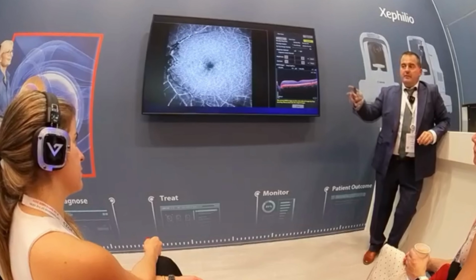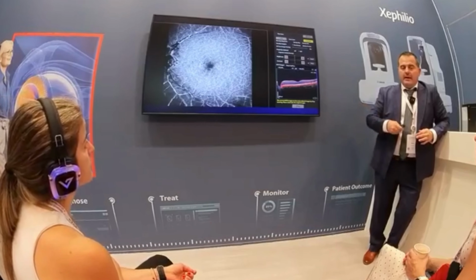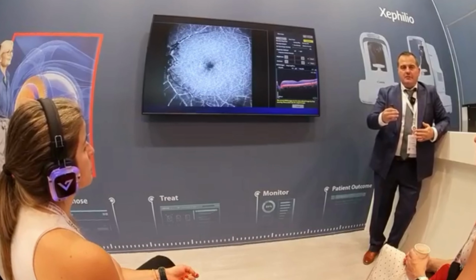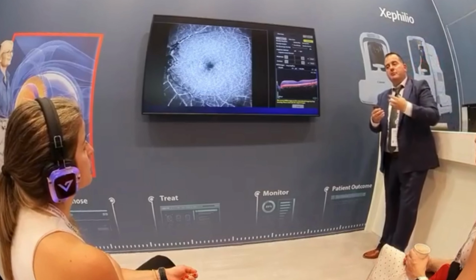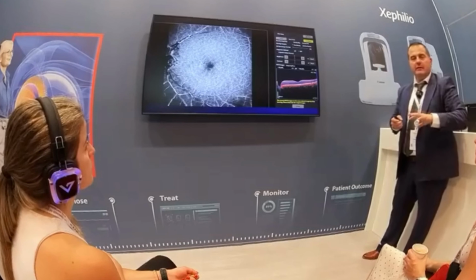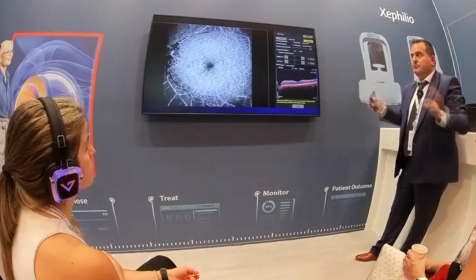So with the help of the capabilities of the Canon A1, it makes me a better medical practitioner, because I can be trustworthy. Otherwise, if I cannot explain to the patient what is actually happening, he might think that I try to fool him just to get rid of him and abandon him.